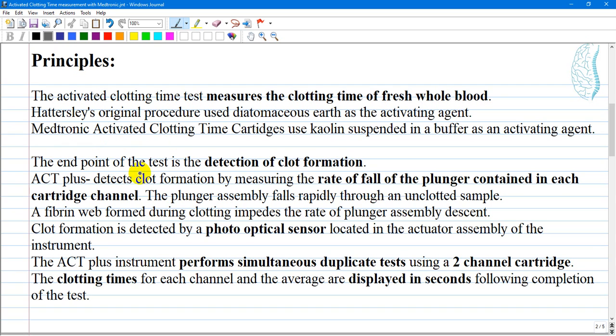The end point of the test is the detection of blood clot formation. ACT+ detects clot formation by measuring the rate of fall of a plunger contained in each cartridge channel. The plunger assembly falls rapidly through an unclotted sample; a fibrin web formed during clotting impedes the rate of plunger assembly descent.